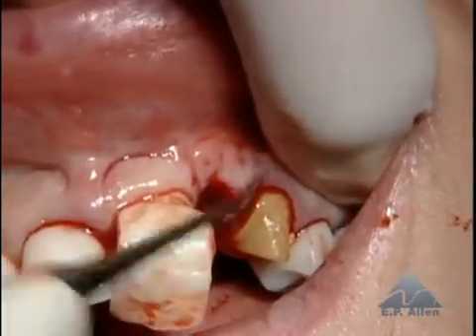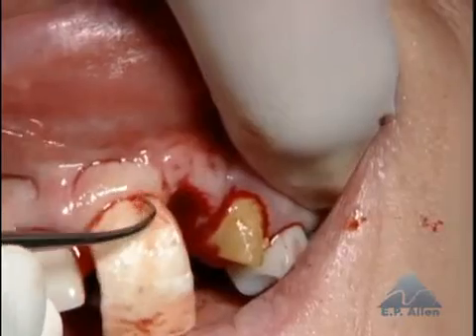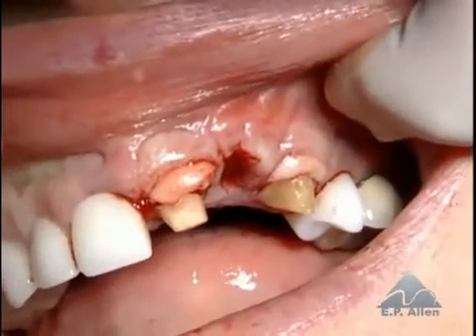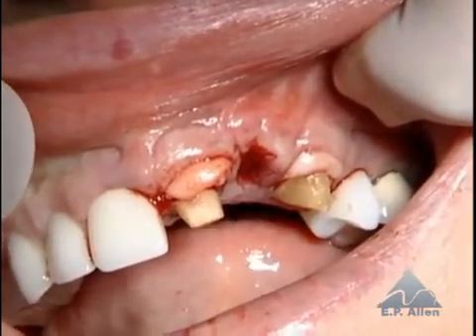So we have the graft introduced initially, and this really is one of the more tedious parts of the procedure. Now we have the graft exposed over the canine and over the central incisor. I can find it also in the pontic area.